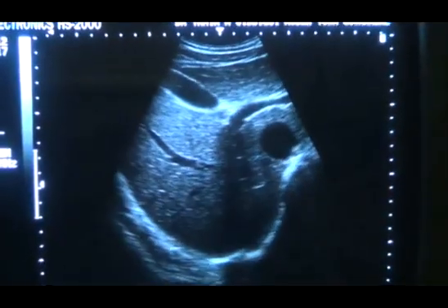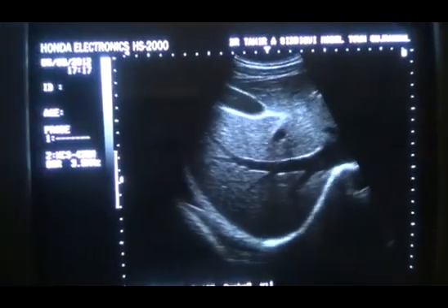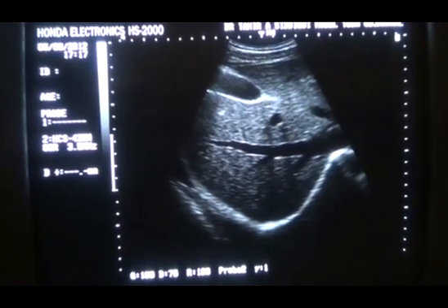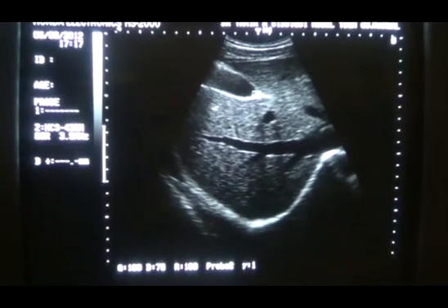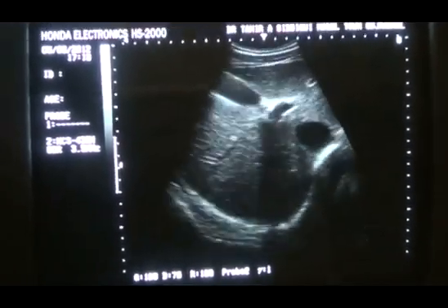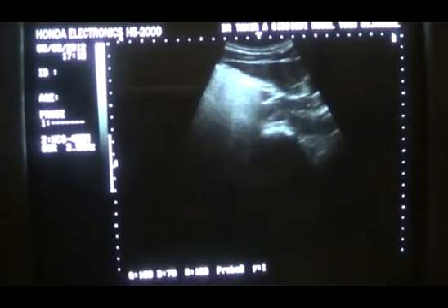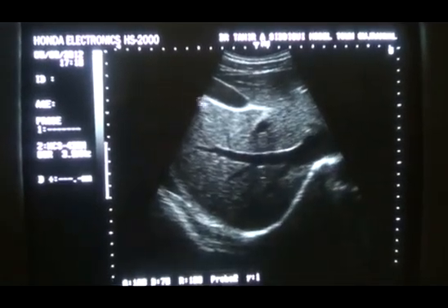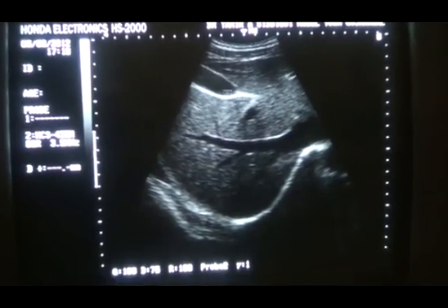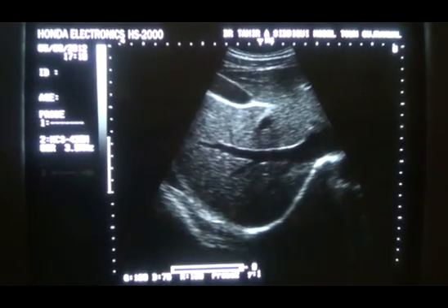By placing the probe in this plan, I do find the gallbladder. This is the median interlobar fissure. This is the gallbladder. This is the neck of the gallbladder, and this is the landmark for the identification of the gallbladder. With this scanning plan — placing the probe in line with the subcostal area, upper part in line with the xiphoid process, and acutely angling it towards the patient's right shoulder — you get a view of the gallbladder with the median lobar fissure as its landmark for identification.